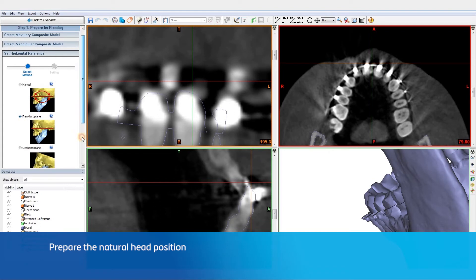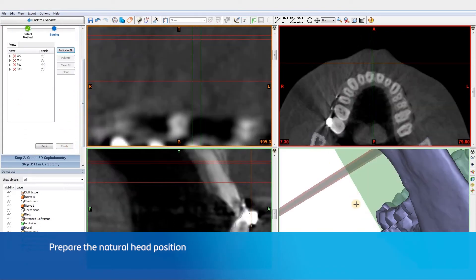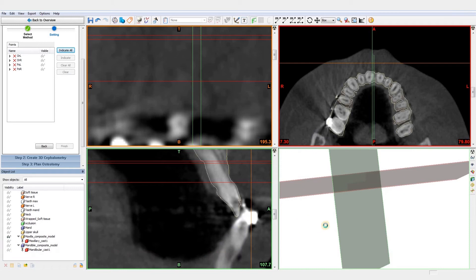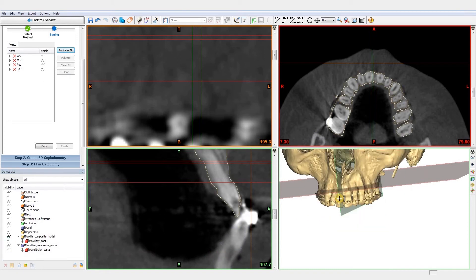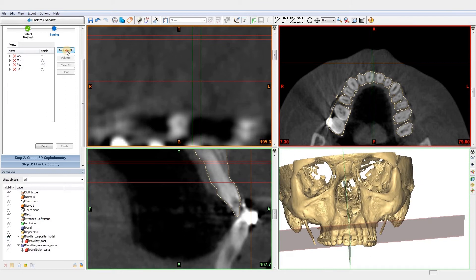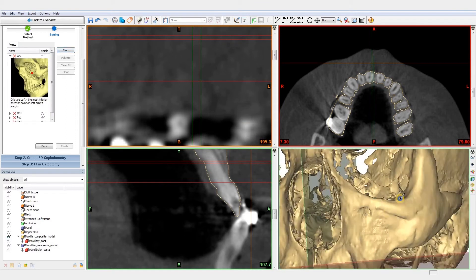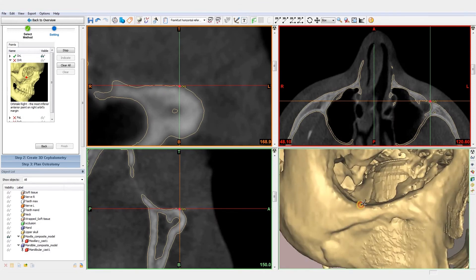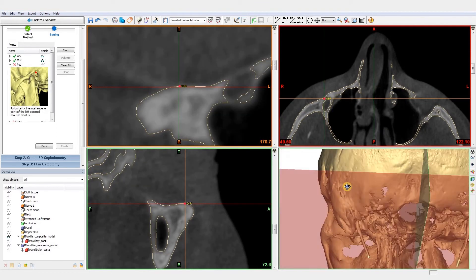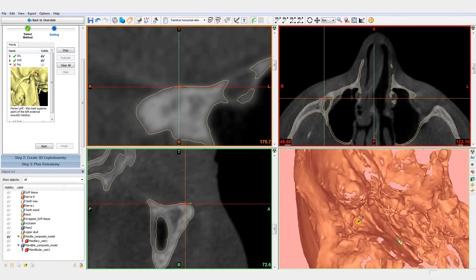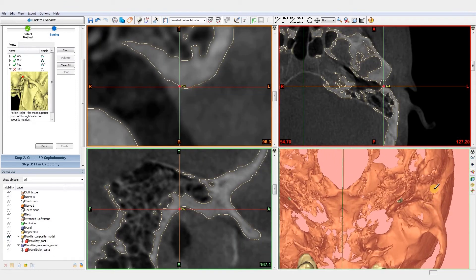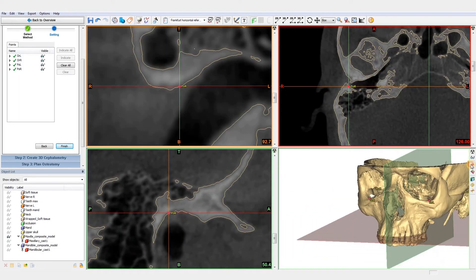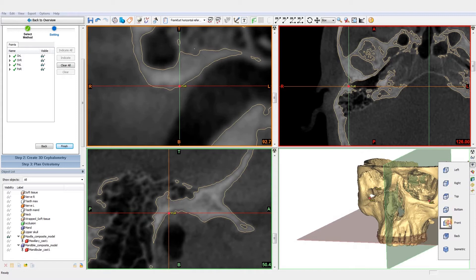Now that we have created our maxilla and mandible composite models, the next step is to set the natural head position. We'll use the Frankfurt plane and follow the instructions to place four points. We'll also adjust the mid-facial plane to obtain our final natural head position. The exact natural head position can still be fine-tuned manually if necessary.